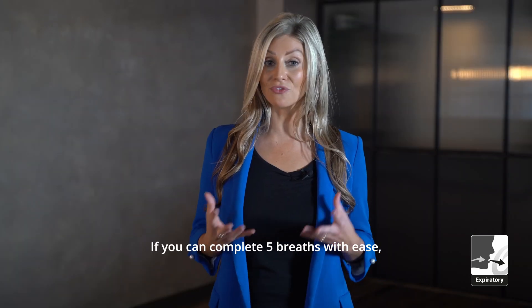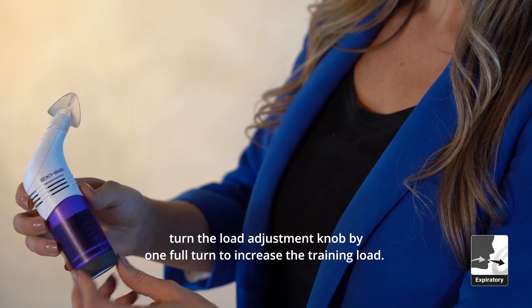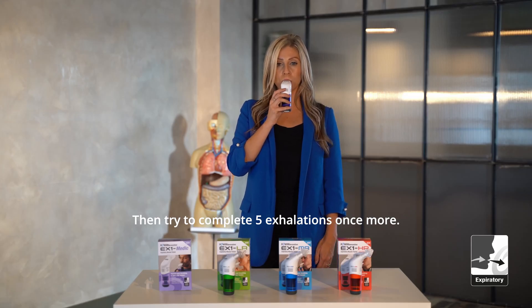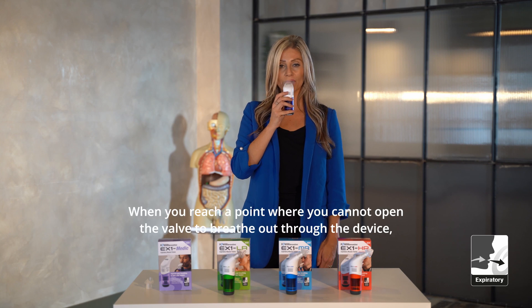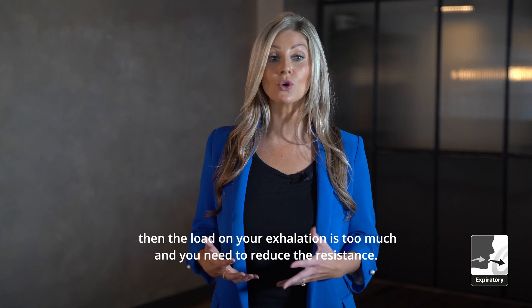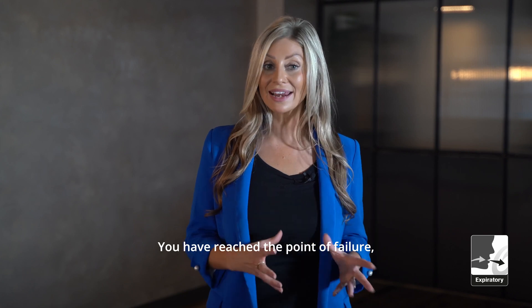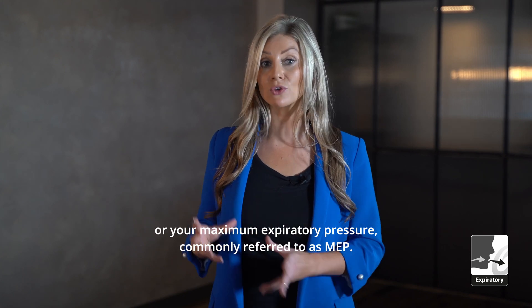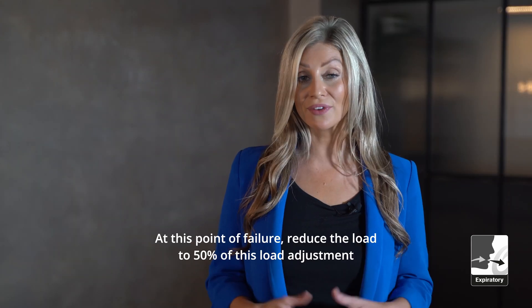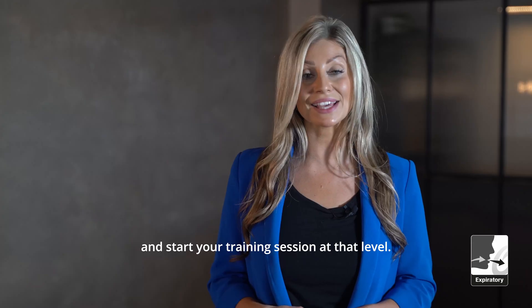If you can complete five breaths with ease, turn the load adjustment knob by one full turn to increase the training load, then try to complete five exhalations once more. When you reach a point where you cannot open the valve to breathe out through the device, the load on your exhalation is too much and you need to reduce the resistance. You have reached the point of failure or maximum expiratory pressure, commonly referred to as MEP. At this point of failure, reduce the load to 50% of this load adjustment and start your training session at that level.